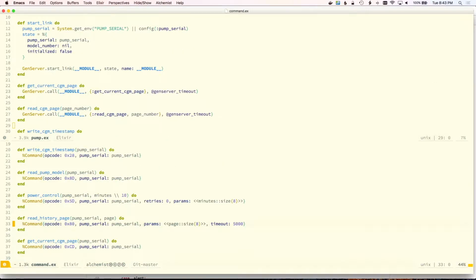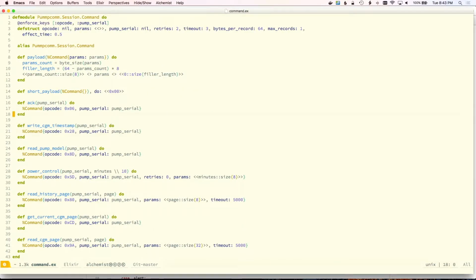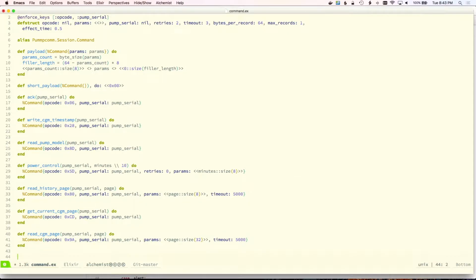So in here, you'll see it's a little bit muddy, but there's one place where all the different commands are defined with all the different opcodes. I haven't really had a need yet to clean this up. I've sort of been deferring the refactoring of this, but I think I'm getting pretty close to the point where I need to do this. For the moment, though, I'm just going to pile on and add one more thing. I'm not doing any test driving or anything. I'm really just trying to spike right now.